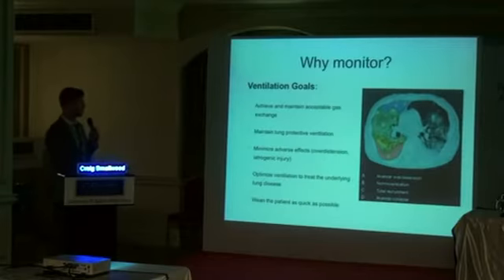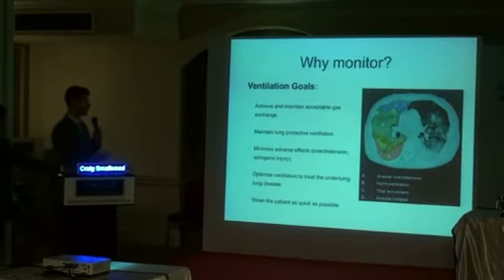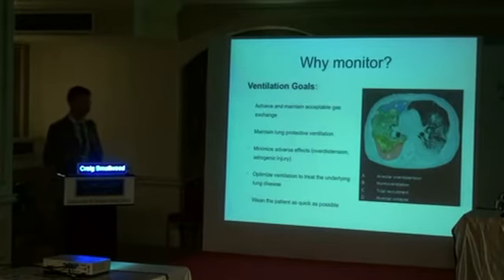Oh, and by the way, this is a figure from a really awesome article on lung injury. What you can see simultaneously is we look at these gross metrics of lung performance, so gas exchange, we can look at overall performance on an X-ray. But you can see during a CT image, in one subject, we have alveolar overdistension, we have normal ventilation here, tidal recruitment, so that is dynamic airway opening and collapse during the breath cycle, as well as total alveolar collapse, all in one breath.